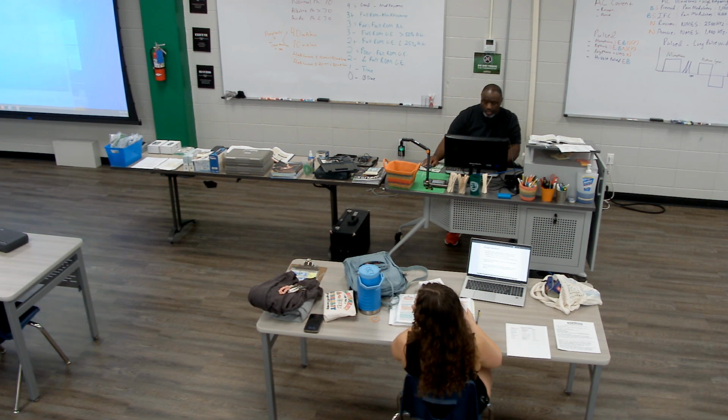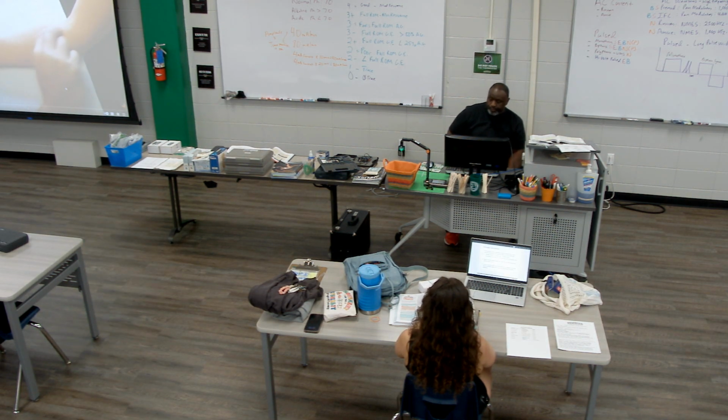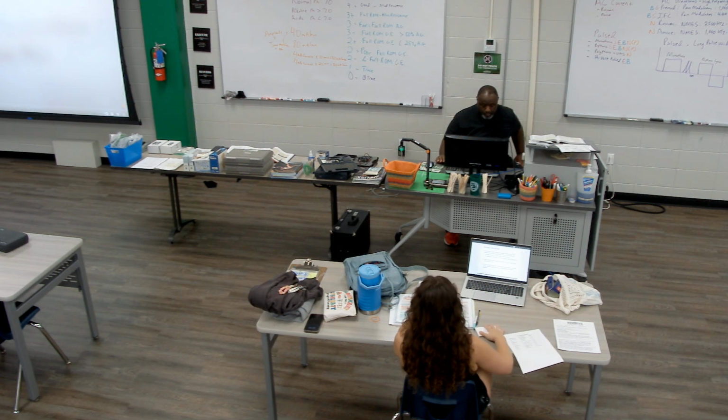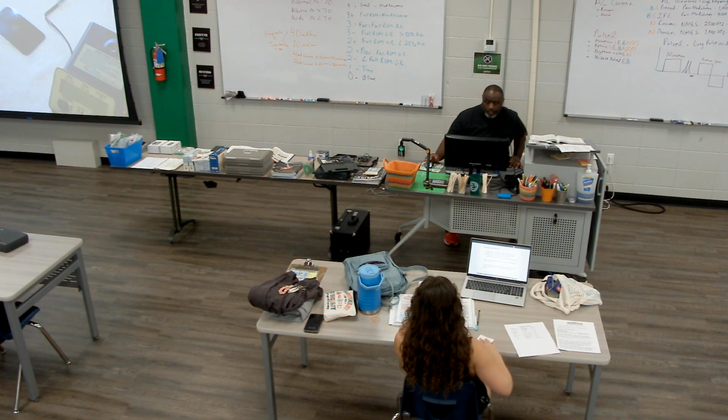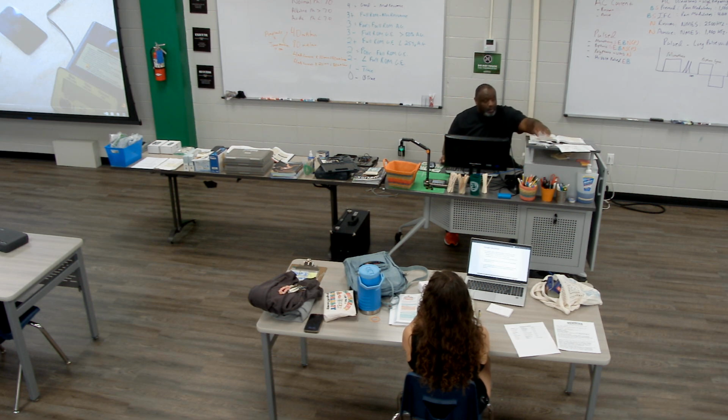Clean skin in preparation for the electrode. Okay, so here we go. Clean skin in preparation for the electrode. Ensure that there is no metal in the area to be treated. Using a syringe, inject the appropriate amount of medication into the pad. Now you want to spread it around. You don't want to just hold it in one spot. Spread it around so you get good coverage over the whole sponge part of the electrode. So this is a sponge, and I'll show you how you put medication on it in just a second.